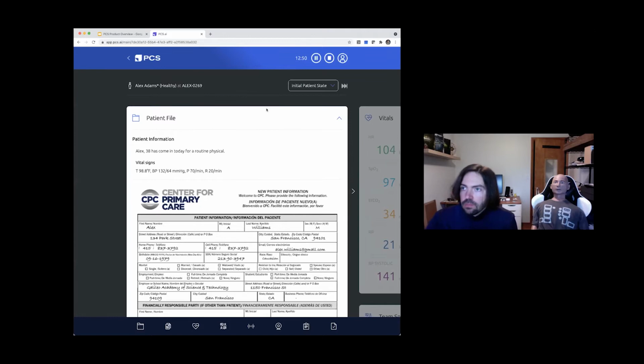Alex software requires upgrades from time to time. Alex software is always internet connected. So whenever an update comes in, you will have the update automatically coming into the software as well.